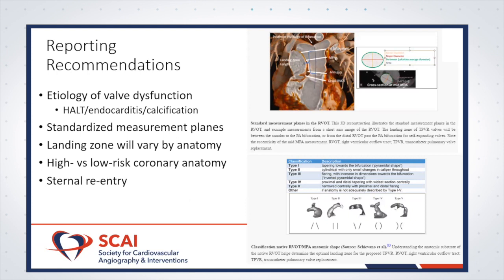And in terms of a standardized approach, it's also really important to look at the variability of the right ventricular outflow tract and have a detailed, patient-specific landing zone that matches the patient's anatomy.